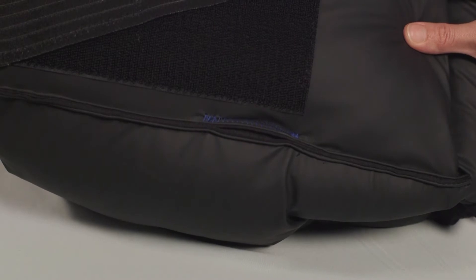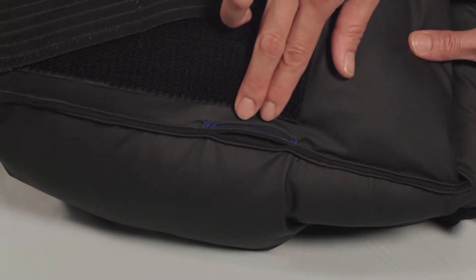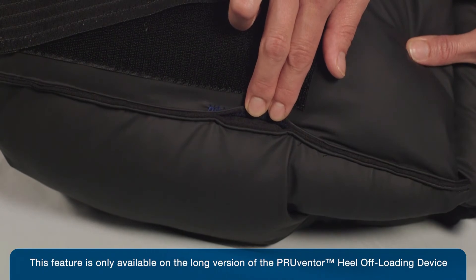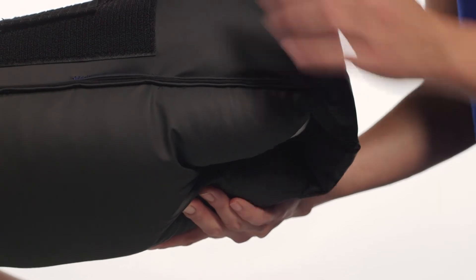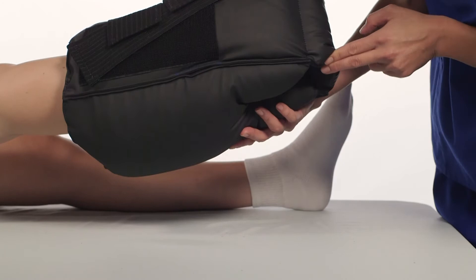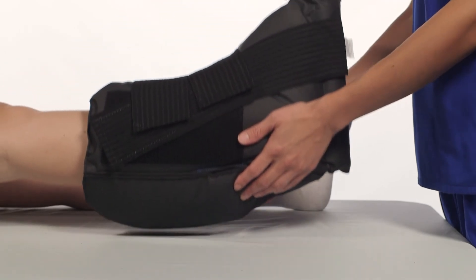If the Preventor boot is used in conjunction with a sequential or intermittent compression device, make sure the tubing exits the top of the boot or through the access ports located on either side of the boot. Do not use the heel opening as an access port for sequential compression devices. Make sure tubing is not bent inside the boot and that it is not resting on the patient's skin. Finally, make sure the heel is suspended. Check the bottom of the boot to ensure that nothing is touching the heel.